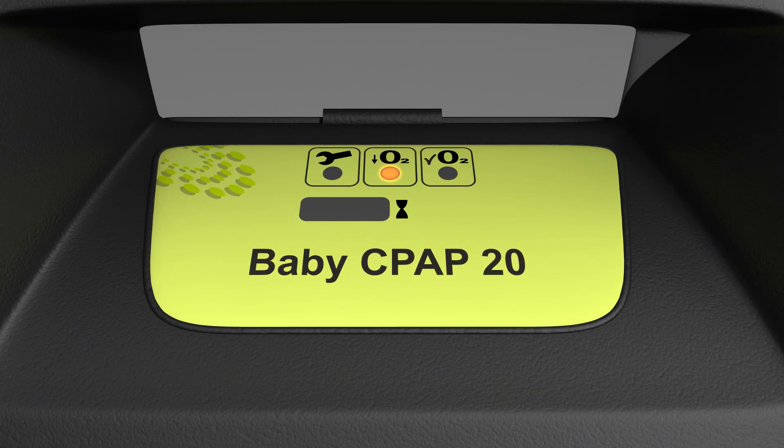An orange light will illuminate. The orange light will turn off and a green light will come on, indicating that the concentration of oxygen being produced is above 85%.